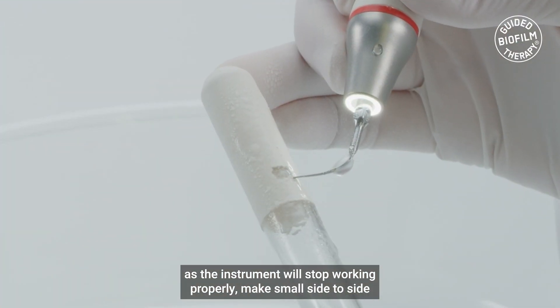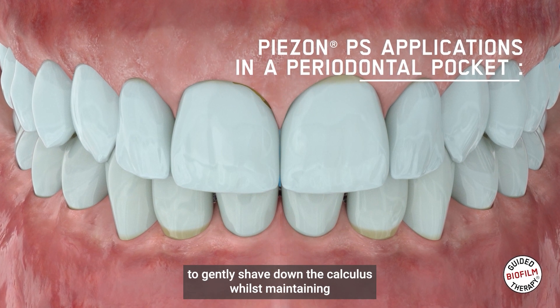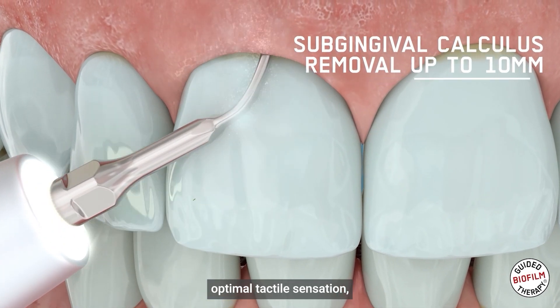Make small side-to-side stroking movements as you enter the periodontal pocket to gently shave down the calculus whilst maintaining optimal tactile sensation.